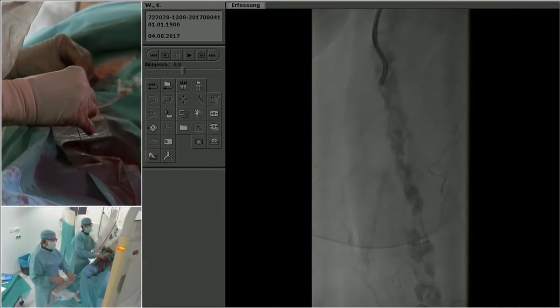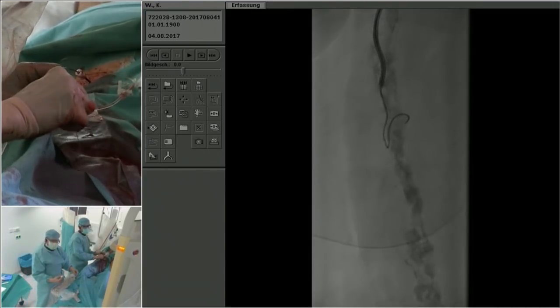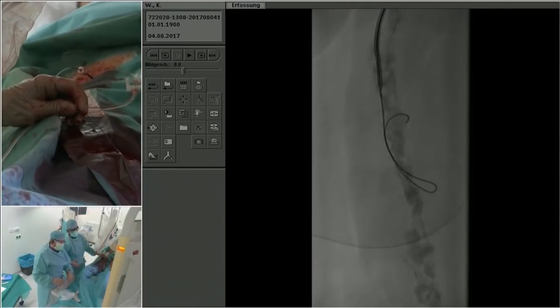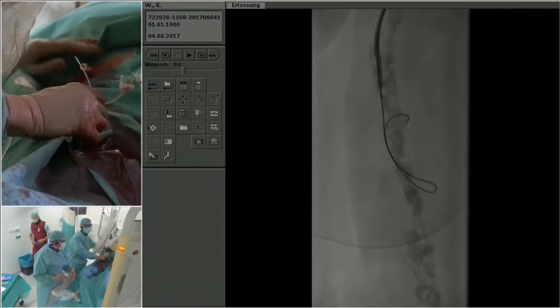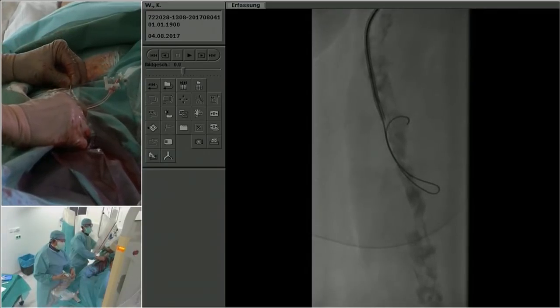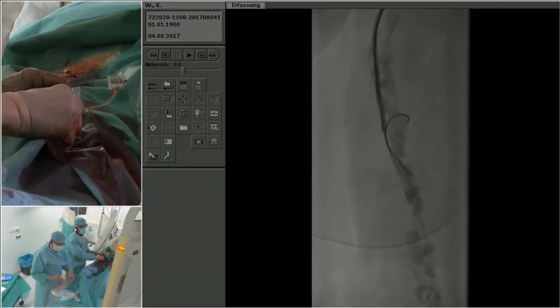I tend to use primarily a support catheter wire strategy, and I think a concern here, even with a CTO crossing device, would be that you'd still redirect into the collateral. The one exception could be using a laser, perhaps with a step-by-step technique to soften that cap, so then you could engage the wire better.